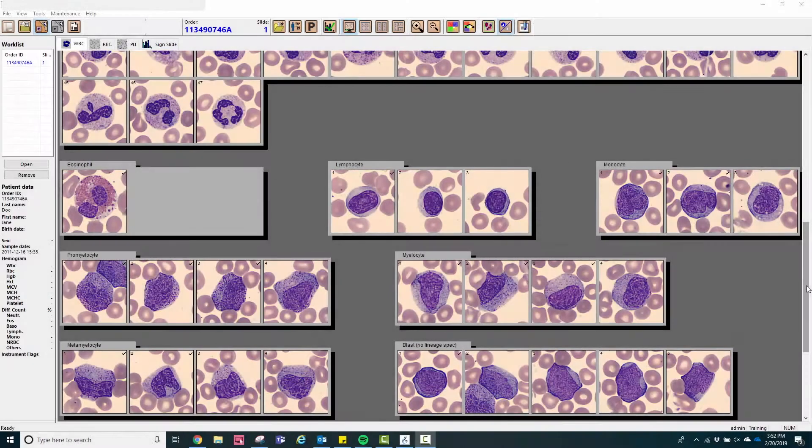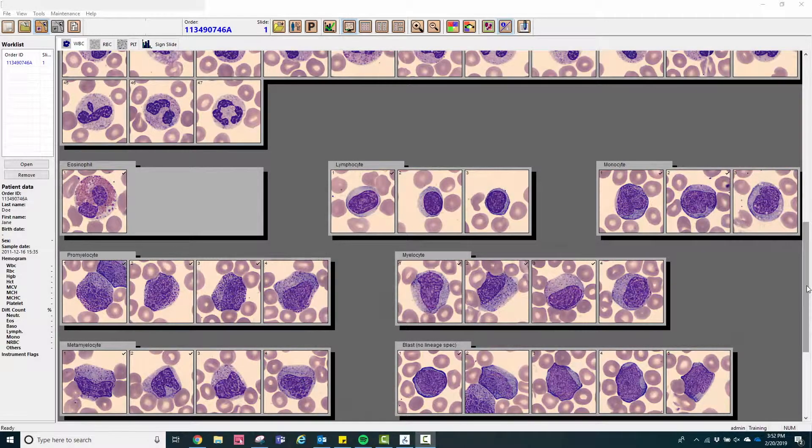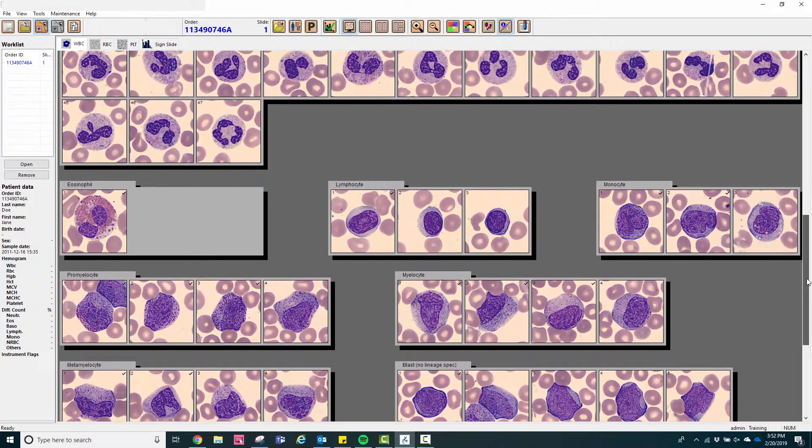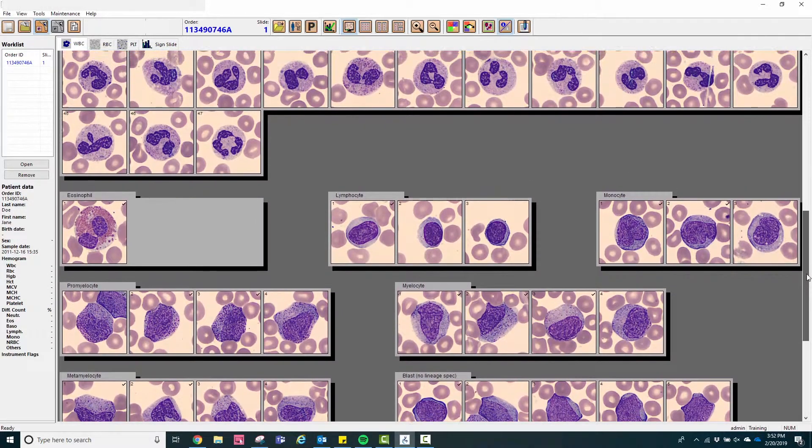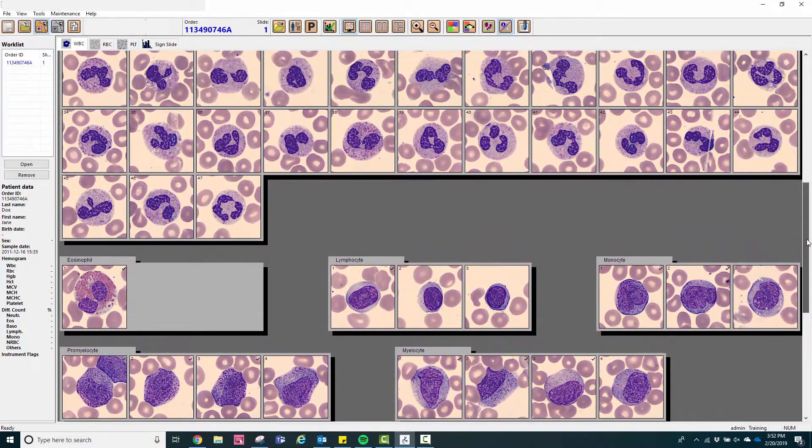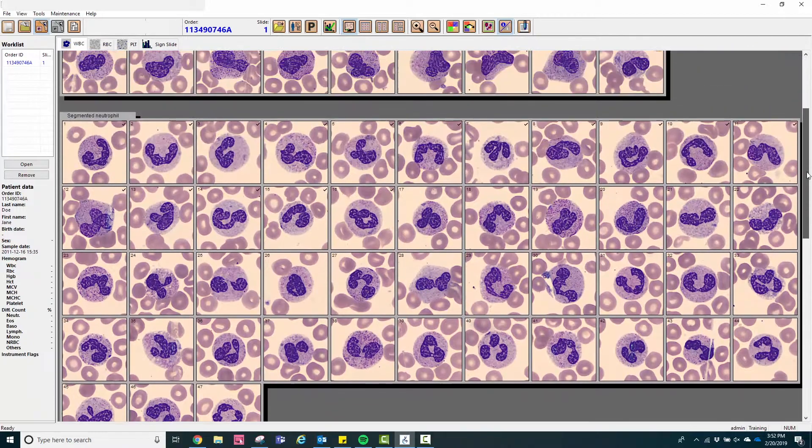Our first case illustrates myeloid cells at various stages of development. Currently available systems continue to rely heavily on technologists' input.